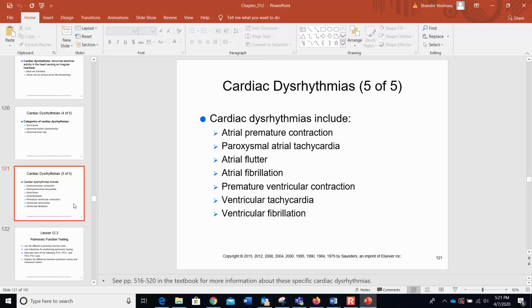So what tends to happen here is it's an irregular, chaotic undulation of the baseline. So you're just seeing a lot of sawtooth, scraggly looking scribbles on the actual EKG sheet. So there's no recognizable P waves. The QRS complexes or T waves, they're all in an irregular line of jagged spikes. So if you've ever looked at an old hand saw, it kind of looks like that.